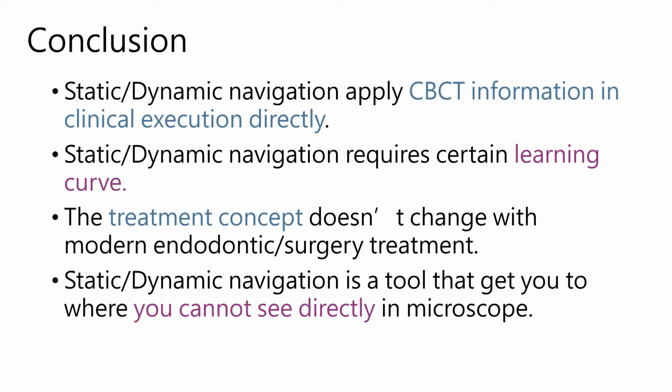And the conclusion is that static and dynamic navigation apply the CBCT information directly into your execution, rather than you seeing the CBCT and thinking, where is it? You can get the information directly, but it requires a certain learning curve. It's not very easy. And the treatment concept doesn't change at all in modern dental, endodontic, or surgery. The concept is all the same. It's just a tool.